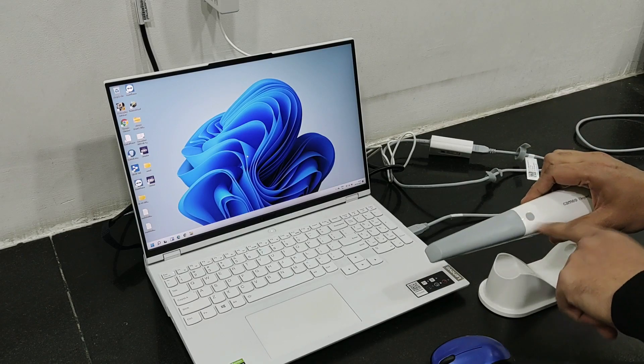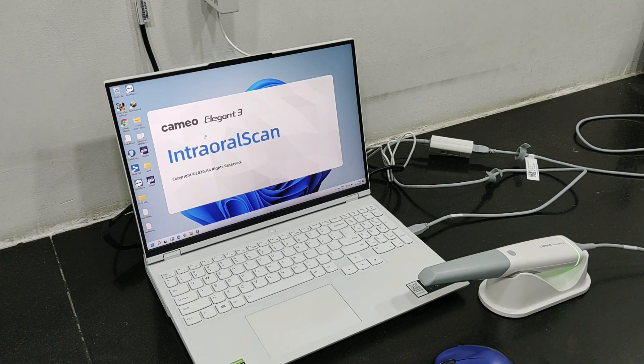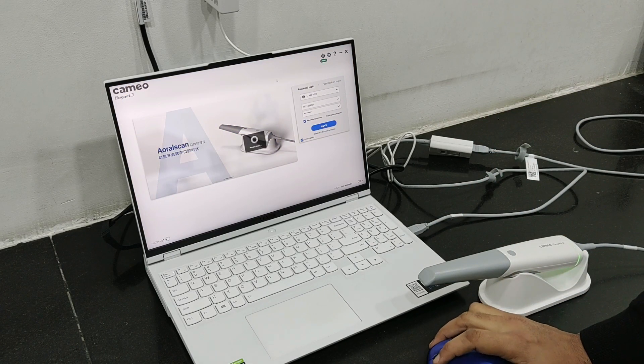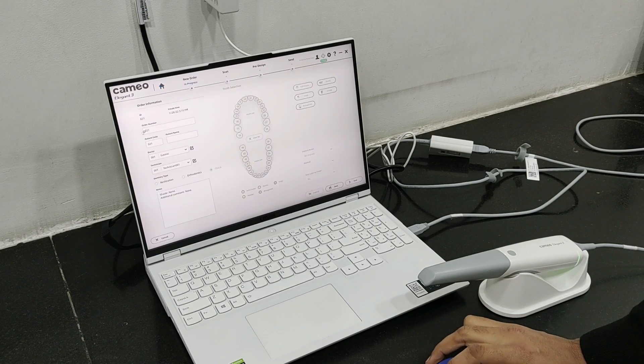We remove this cover and attach a scanning tip — like this. It turns green now. Let's open the software. This is the Dental Launcher software. We have already loaded the software into the laptop. Let's sign into it.